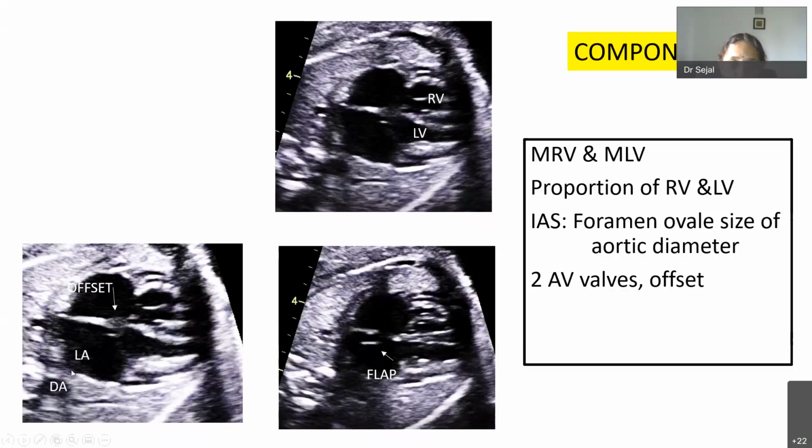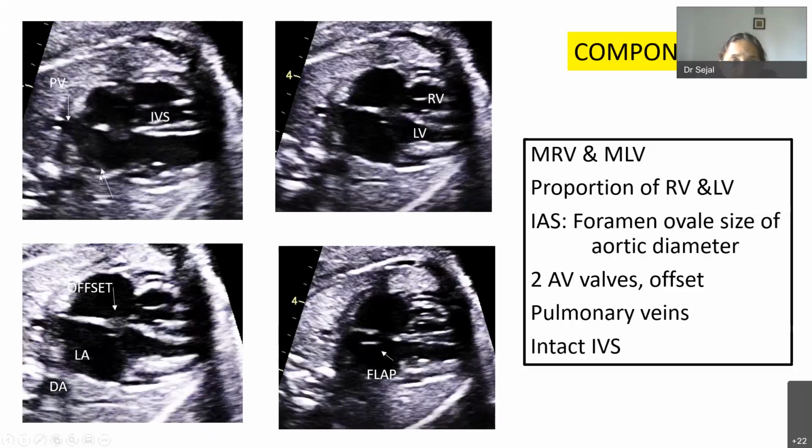So it's very important that the gap between the left atrium and the descending aorta is not much. The next thing is the pulmonary veins. We need to make sure that the shape of the left atrium looks like pulled ears. It's typically understood as pulled ears, as if there's something pulling the ears. This appreciation is important. If the left atrium looks bald and there is a gap, sort of a chamber, between the left atrium and descending aorta, all of you know what to suspect.